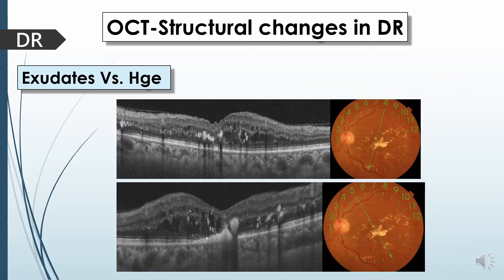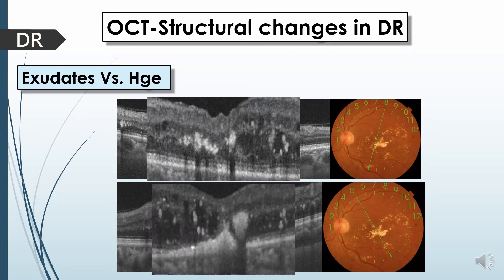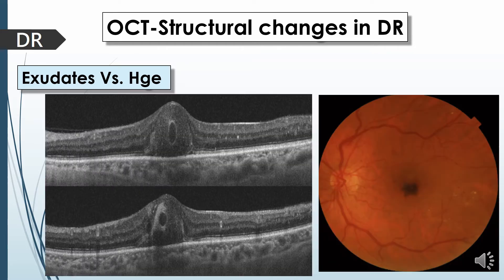Hard exudates appear as hyperreflective material deposited in the inner and middle retina; however, in some cases they are deposited at the outer retina, which carries a poor prognostic value due to loss of the outer retinal cells. Retinal hemorrhages appear as hyperreflective or moderately reflective material deposited in the inner retina; however, in selected cases they may involve the whole fovea, and we should return to the color photos for proper differentiation between hemorrhages and exudates.